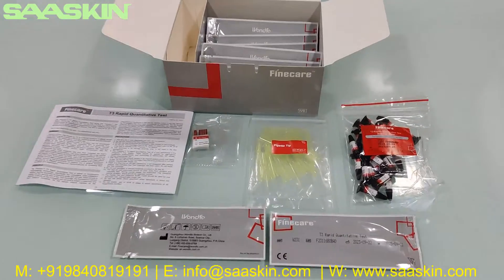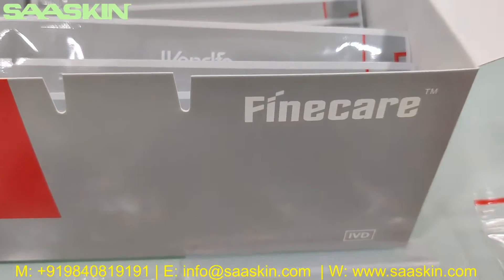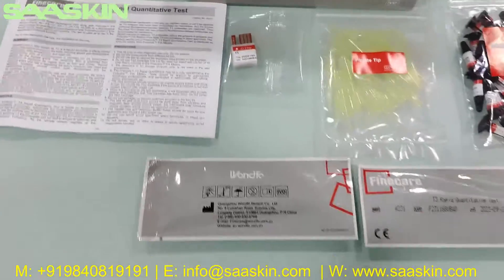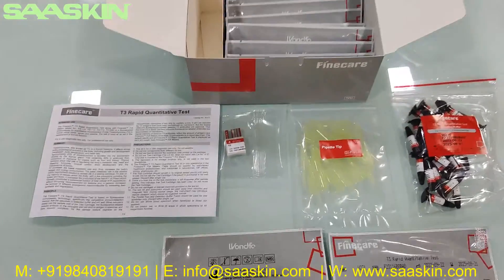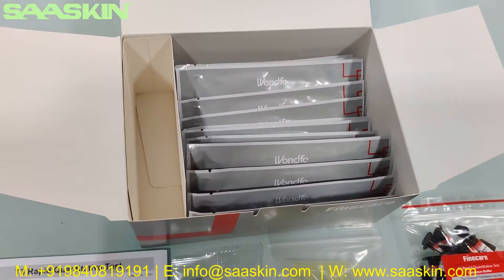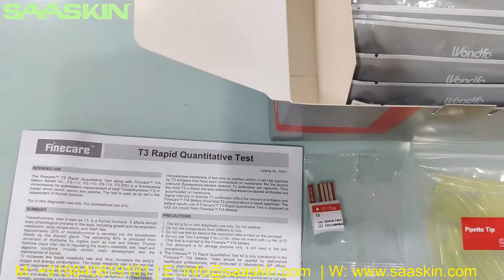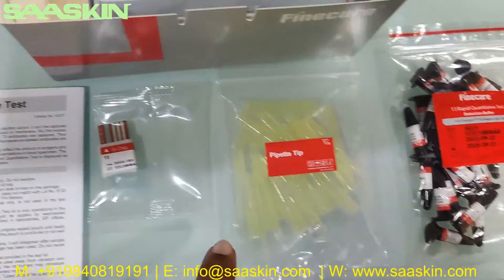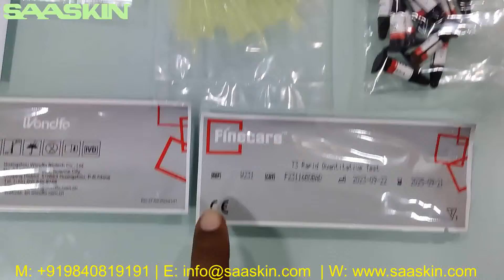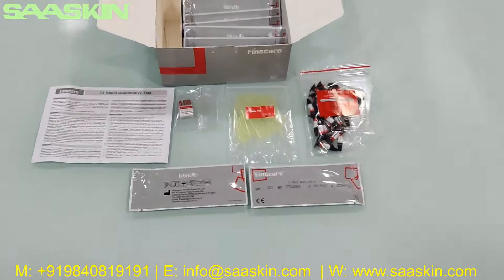Quickly to summarize: today we have seen the unboxing of FineCare T3 Rapid Quantitative Test, which is used for testing thyroid function. In the 25 test kit pack, you get one instruction for use brochure, one ID chip, 25 pipette tips, 25 detection buffer tubes, and 25 test cassettes. This is how the total test kit looks like.